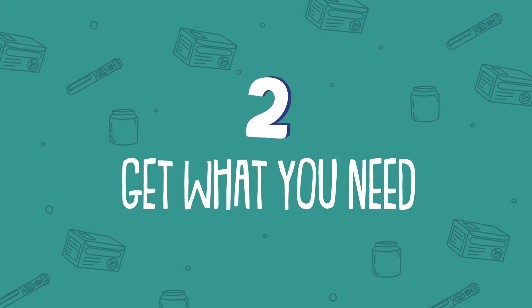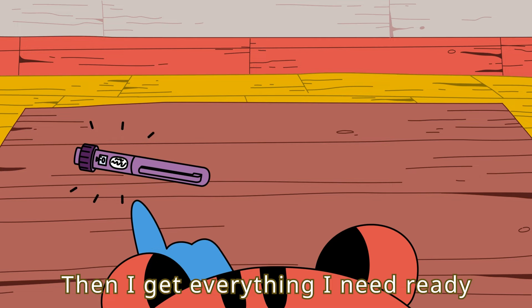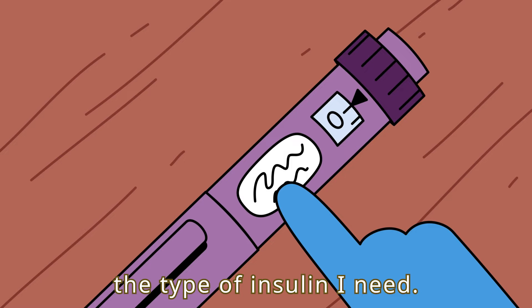Step 2: Get what you need. Then, I get everything I need ready before I start. I always check the pen label to make sure the pen contains the type of insulin I need.